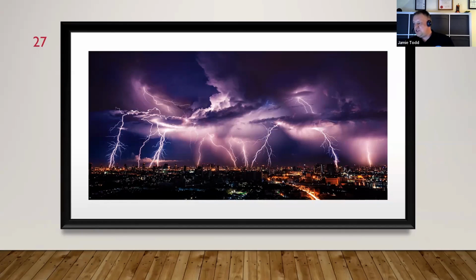There might be a little bit more off-the-chest time, but it's about measuring risk, isn't it? What is the greater risk: failing to deliver defibrillation, or shocking something that subsequently might turn out to not be a shockable rhythm? I think the greater risk is not delivering defibrillation. Shocking a non-shockable rhythm, with little difference in pauses in CPR, probably just uses battery life. And the latter would never be intentional. We wouldn't intentionally shock a non-shockable rhythm, but it is safer, after 2 or 2.5 seconds, to make a decision than not to deliver defibrillation, in my opinion.